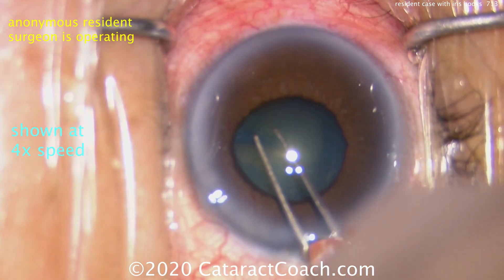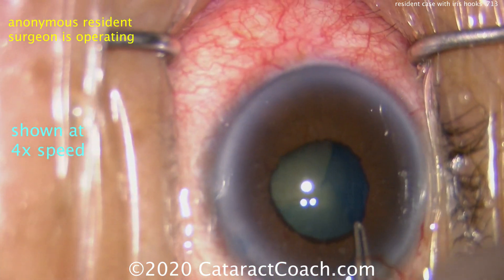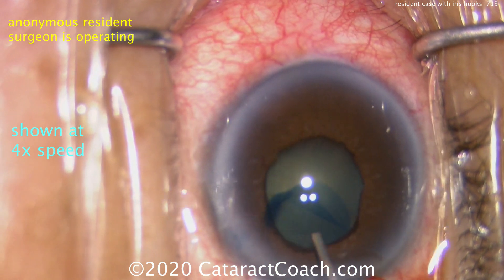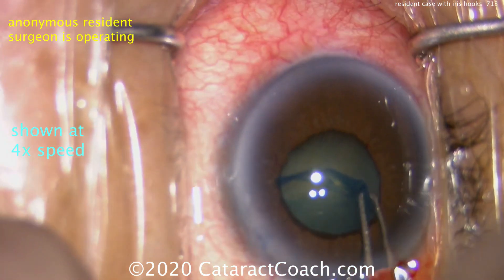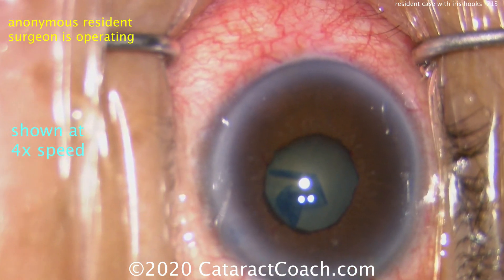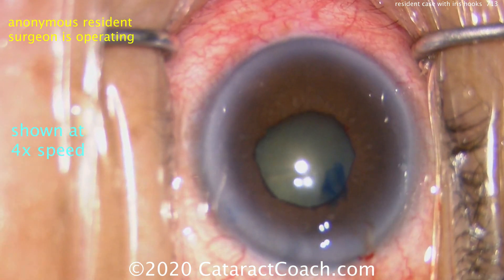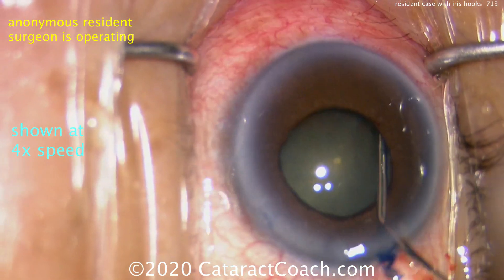Certainly that's a possibility as well. But the catch is, it's harder to visualize the capsulorhexis edge because the pupil is not expanded yet. So more viscoelastic was used for the viscomydriasis, plus another aliquot of viscoelastic. And a good capsulorhexis has been completed.